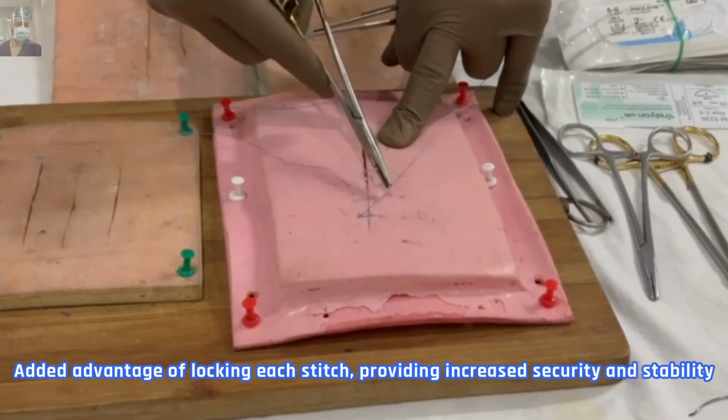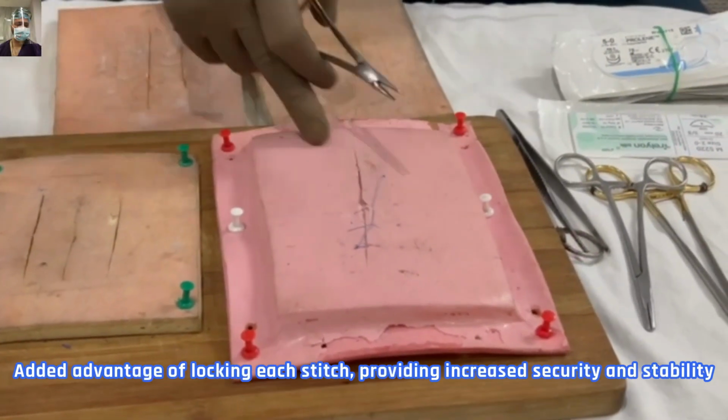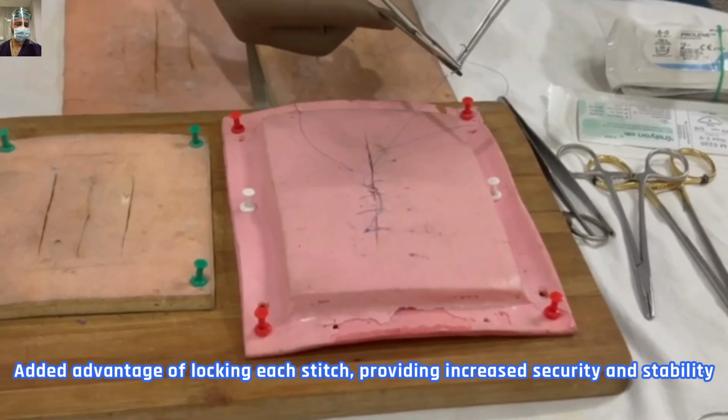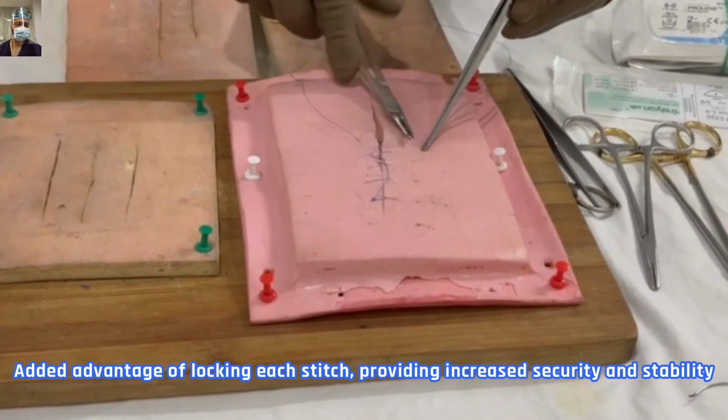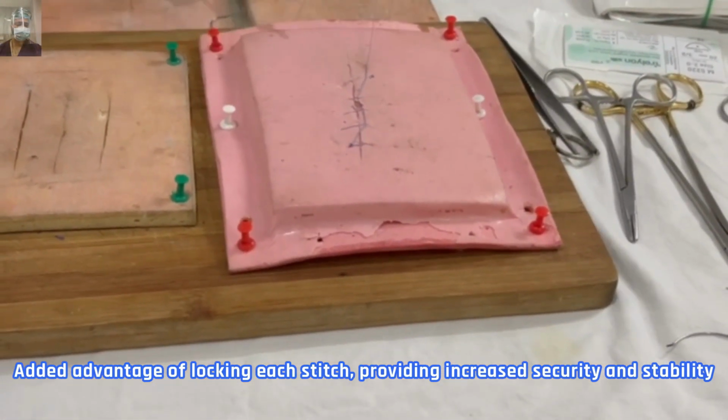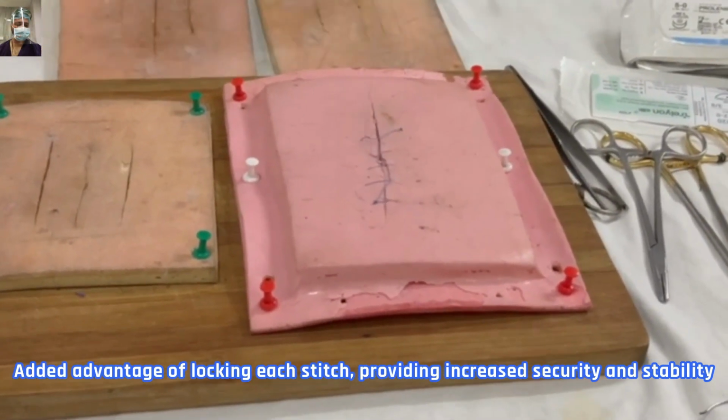So again, for a long suture, especially where there is bleeding and you want apposition and you don't want the suture to get loosened, this is a good technique. Like if initially you are suturing the scalp with a lot of bleeding, then this suture is very handy.